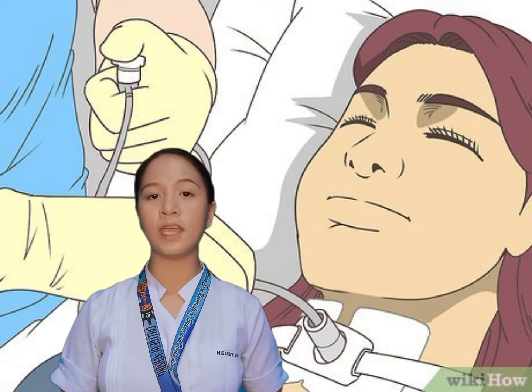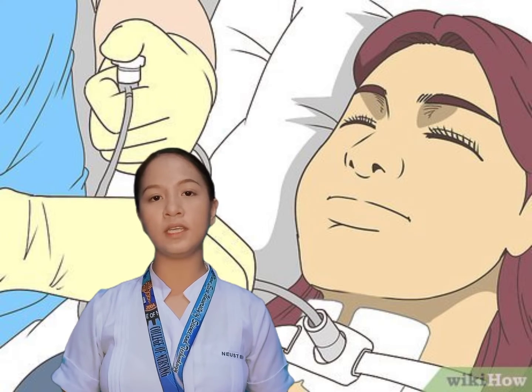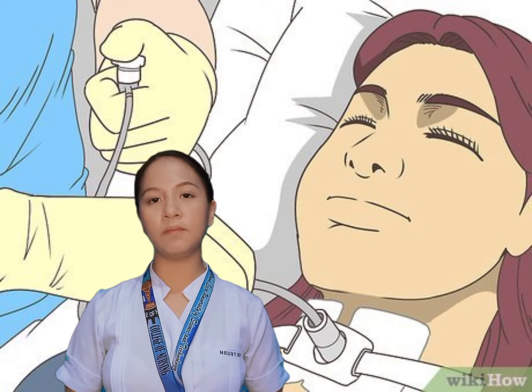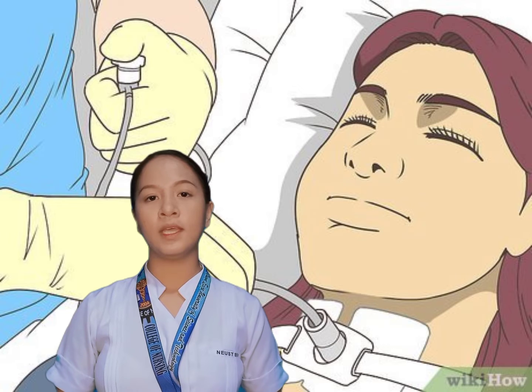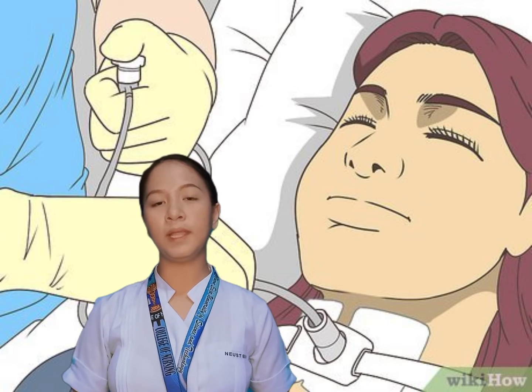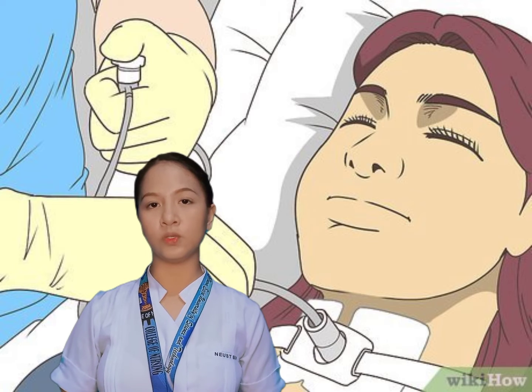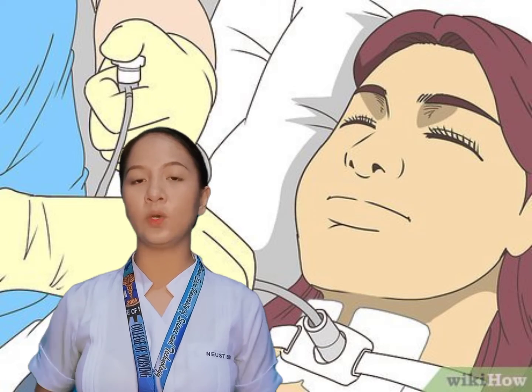Next, simultaneously, gently slide the tracheo pad dressing downward and discard. Next, check for some exudates or drainage, skin breakdown, irritation or inflammation. Clean the inner cannula of the tracheal tube using the prepared plain NSS plus H2O2 and use brush to remove solidified or sticky mucus. Next, rinse using the second basin with plain NSS only.